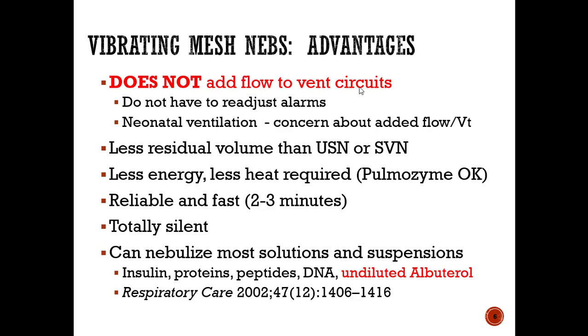So this one, you don't have to hook it up to a flow meter. You're literally turning on a power source. It's vibrating and it's creating that aerosol. So you don't have to readjust your alarms on your vent. For neonatal ventilation in particular, you can really add a lot of tidal volume with a very minimal amount of flow, especially when you're talking about your babies that are about a pound.